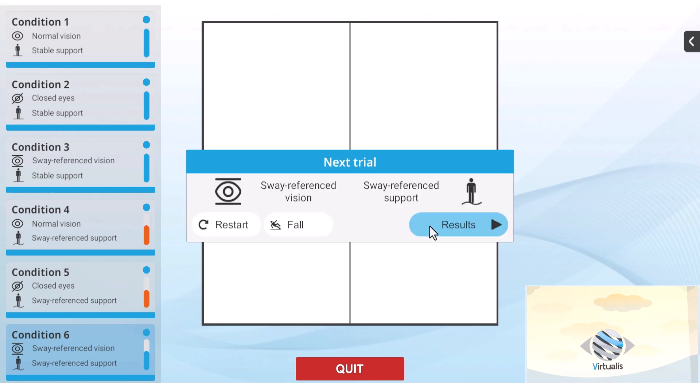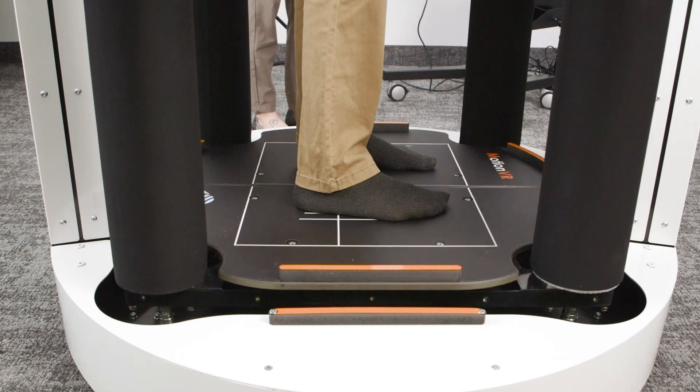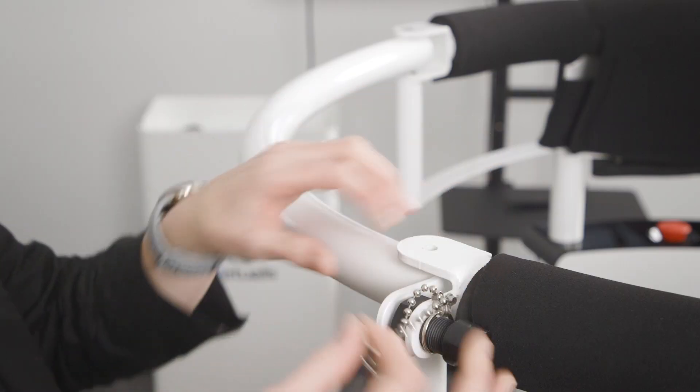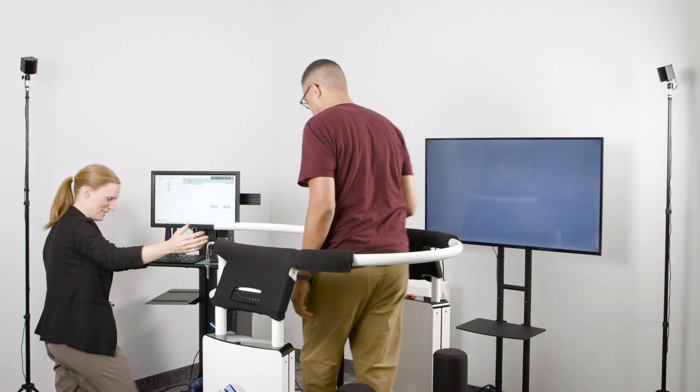Once the assessment is complete, click the results button on the screen and the force plate moves back into the lowered position. Open the safety ring and assist the patient with removing the headset and stepping off the platform.